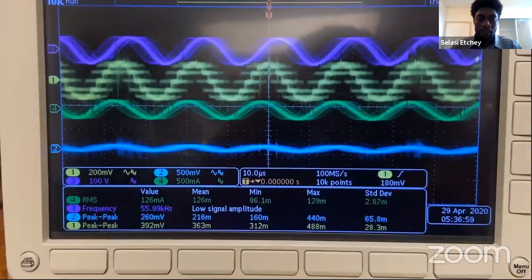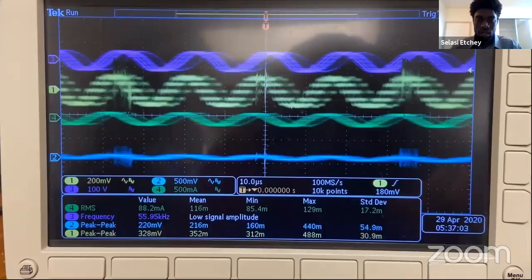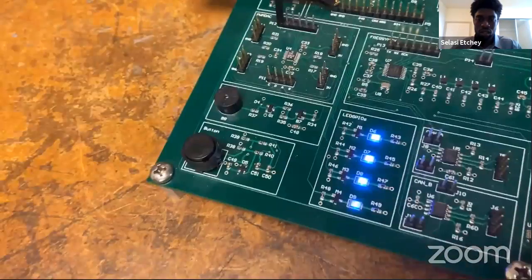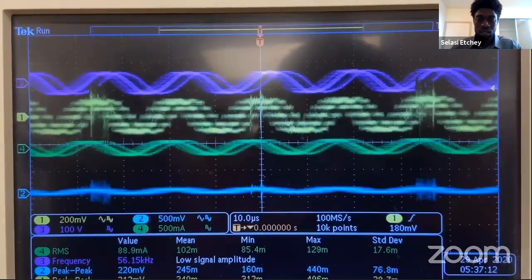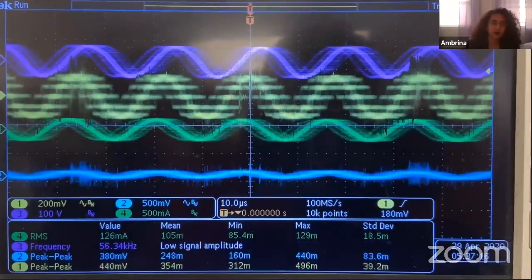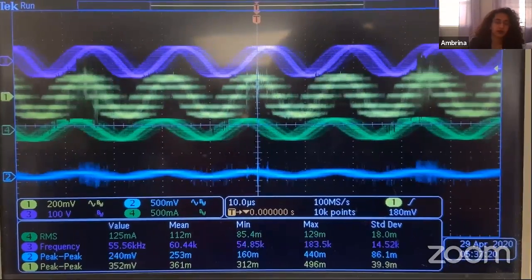So when we click it now, we go to 90 milliamps RMS, and we do this through a 2-phase button that we have on the motherboard. This is our lower energy mode, and we increase it by pressing it to our higher energy mode, which is 130 milliamps RMS value.